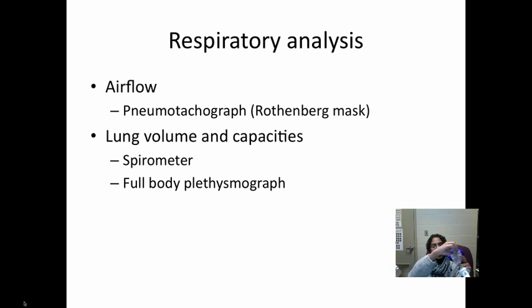One of these, these little tubes that you see here, go in and come through this part right here, and it sits out of the tube like this. Alright, hang on, let me close this away. I'll show it to you. There we go. And then there is a tube that attaches to this part of the small tube, and then this tube sits right here inside the mask.